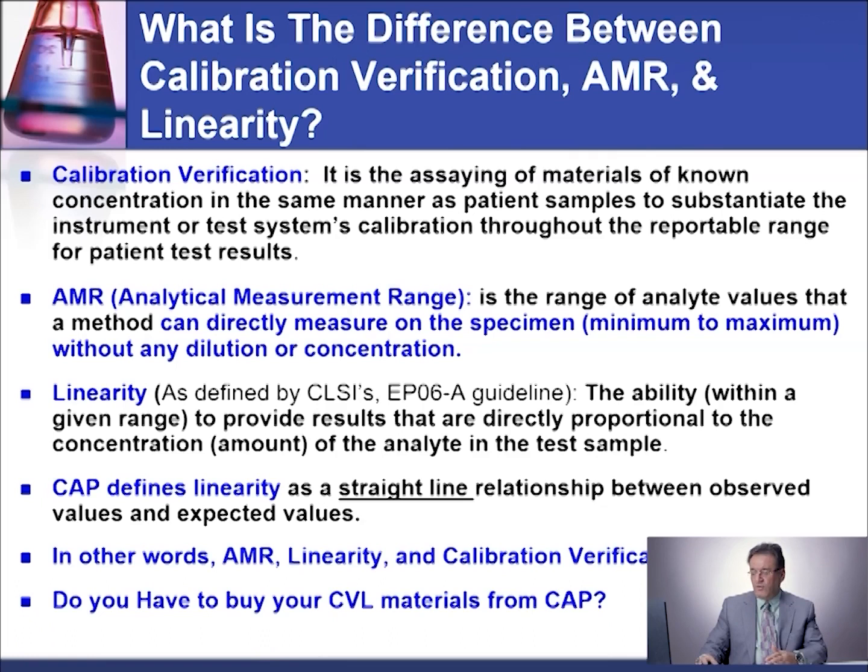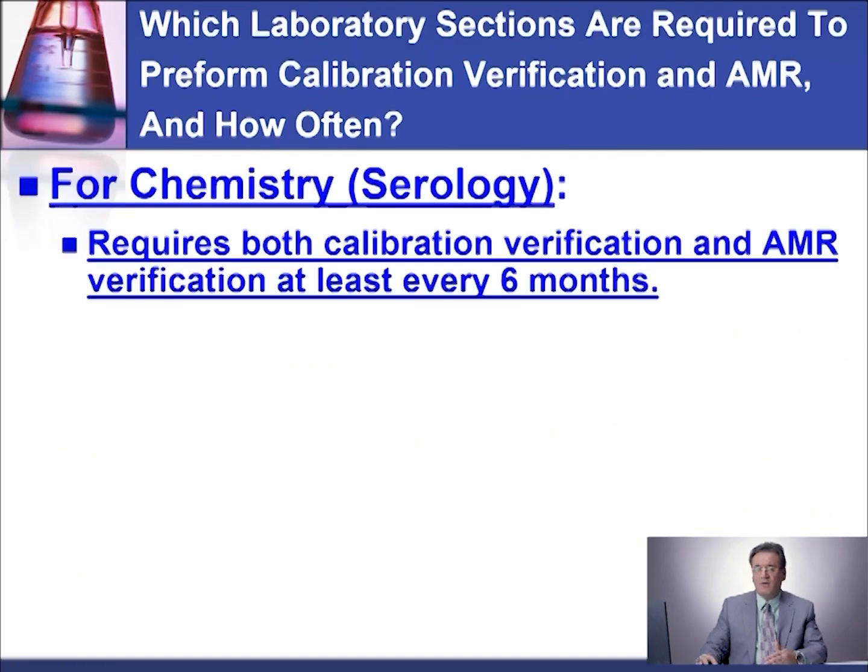Do you have to buy your CVL material from CAP? No, you don't. You don't have to buy the material from CAP. You can have your own, as I will describe, if you can come up with the specimens needed, or you can buy it from some other source who provides linearity products.